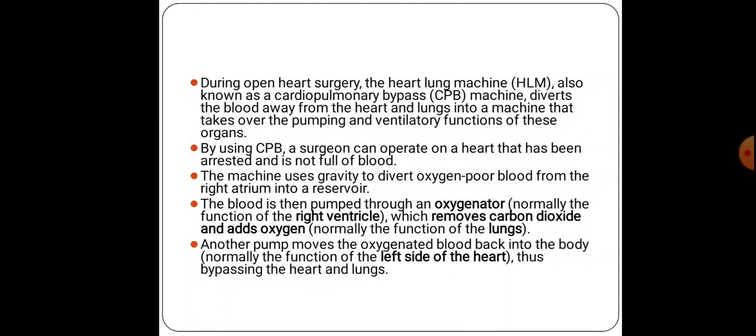So there are three components: reservoirs, oxygenators, and the pump. We can relate the heart and the heart-lung machine components. Oxygenation removes carbon dioxide and adds oxygen, so it is normally the function of the lungs.